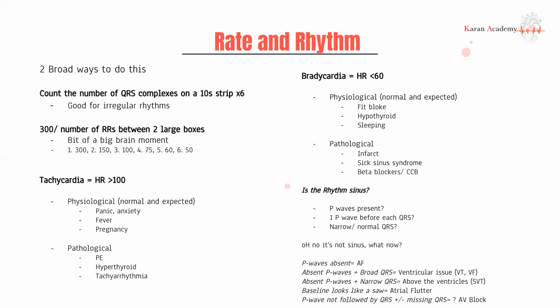With bradys, they can either be physiological or pathological again. Some important ones you need to know are infarctions and medications like beta blockers and calcium channel blockers, which can both cause bradycardias. And then you need to ask yourself, is the rhythm sinus? And I know you get asked this a whole bunch, but I personally didn't understand sinus rhythm for a long while.